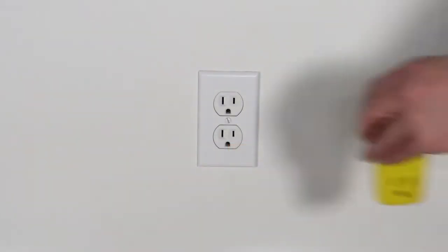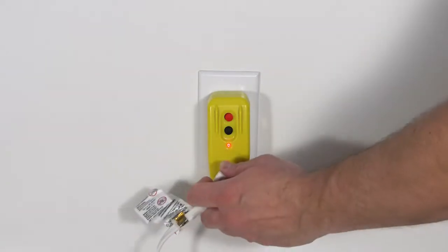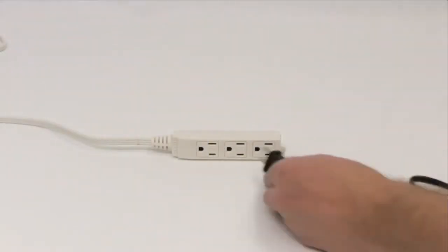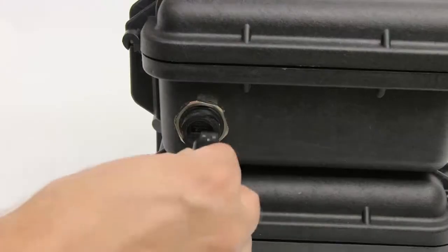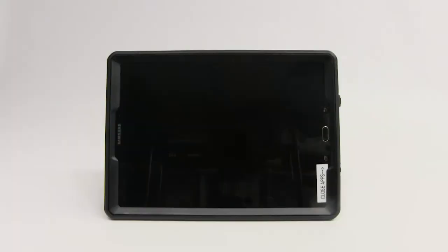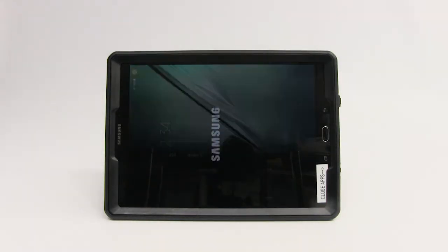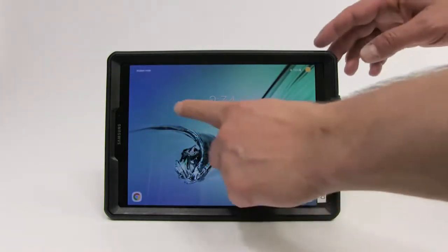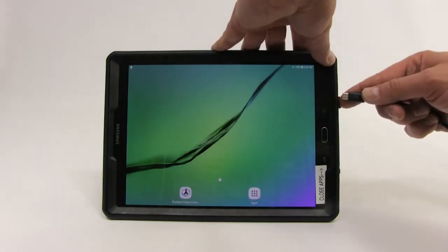Plug the GFCI outlet protector into the wall outlet. Plug an extension cord into the GFCI outlet and then plug a power cord into the extension cord. Plug the USB cable into the back of the pump. Power on the tablet by holding the power button at the top right side for approximately three seconds. Allow adequate time for the tablet to power on and display the home screen, then plug the USB cable into the tablet.